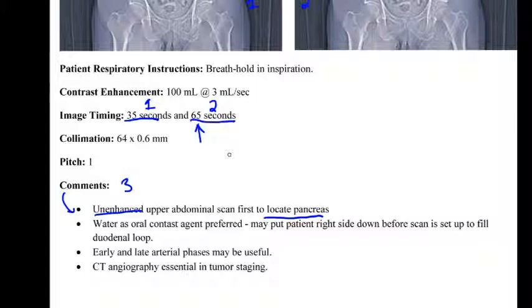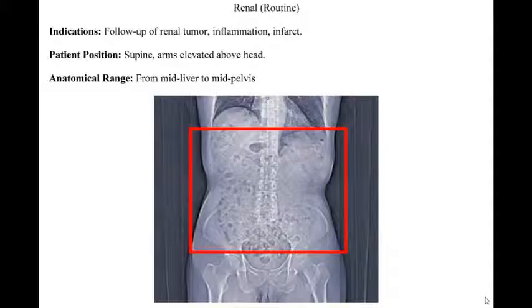Also, CT angiography is essential in tumor staging, and so this may actually require other studies as well. But this is to be helpful in staging a tumor or detecting the presence. And so just keep this in mind, that every department's going to be a little different.